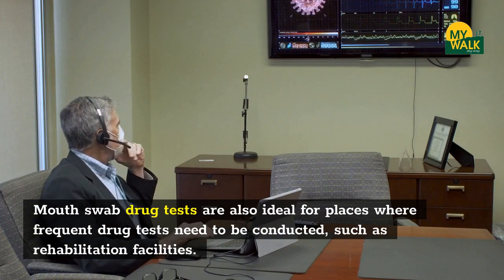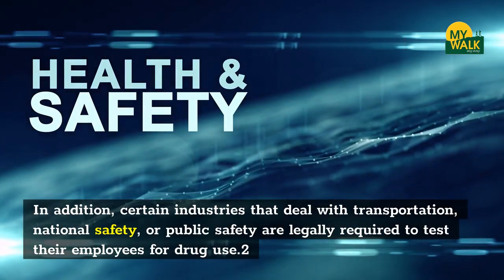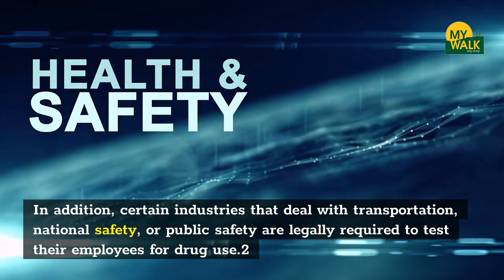Mouth swab drug tests are also ideal for places where frequent drug tests need to be conducted, such as rehabilitation facilities. In addition, certain industries that deal with transportation, national safety, or public safety are legally required to test their employees for drug use.